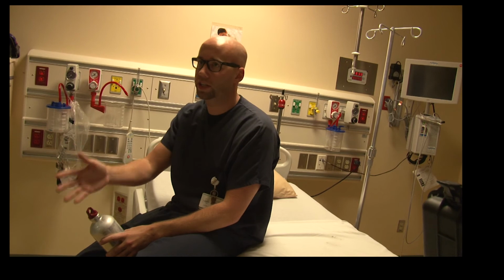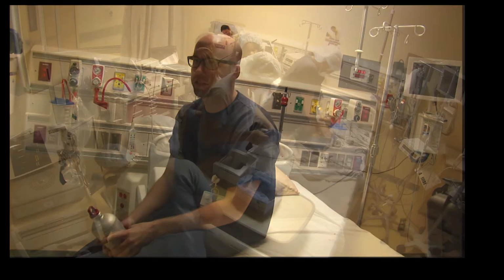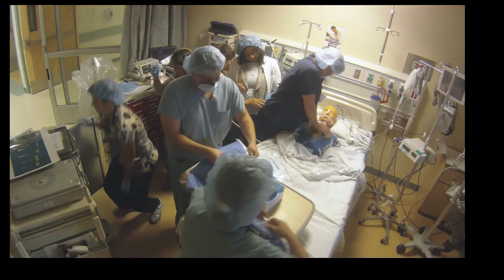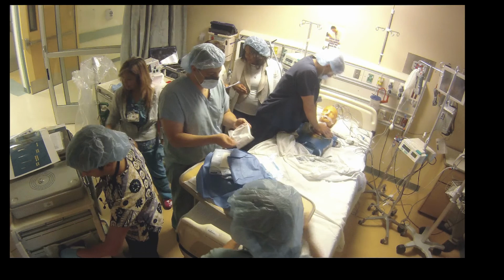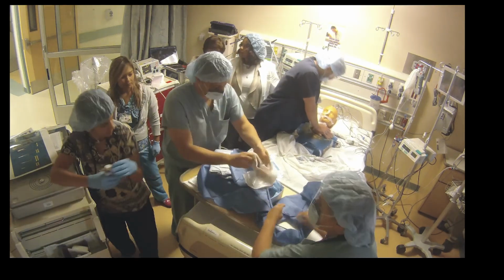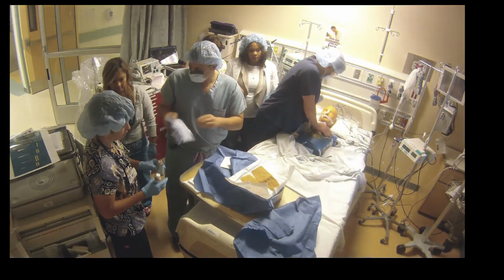Based on team feedback, the video, and lessons learned, the teams now routinely complete the procedure in under 5 minutes in mock codes. Feedback from the nurses indicated that the realistic mannequin, combined with having most of the IV lines, tubes, respiratory and monitoring equipment found in a cardiac surgery ICU room, recreated the highly charged atmosphere of a real code. They felt that this was critical for their confidence in performing the procedure during a real code.